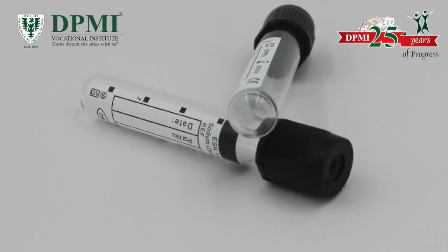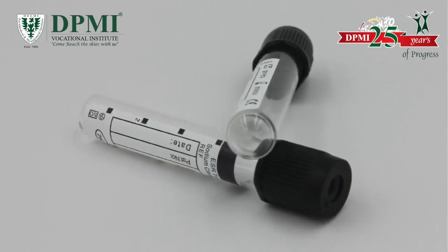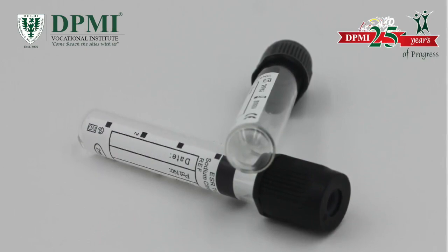Black top. These tubes contain sodium citrate as an anticoagulant. The black top tube is used for Westergren ESR determination.